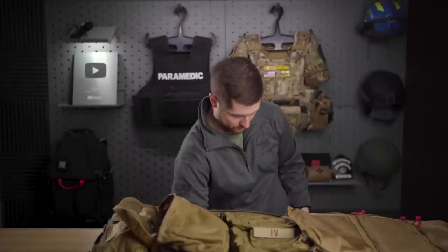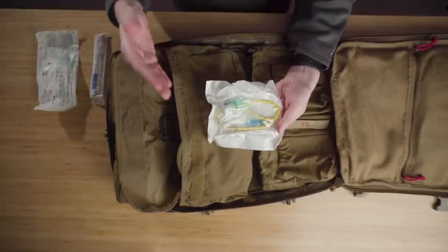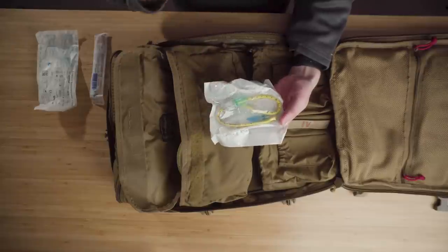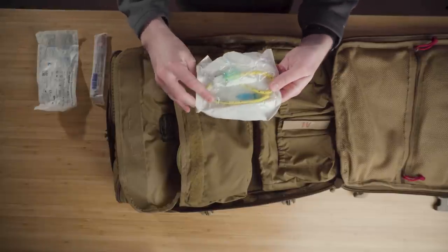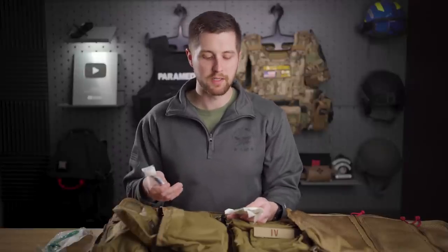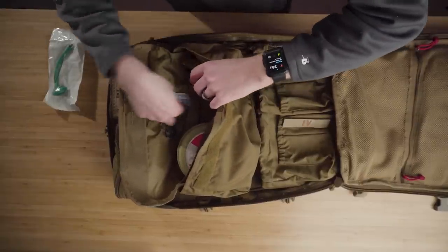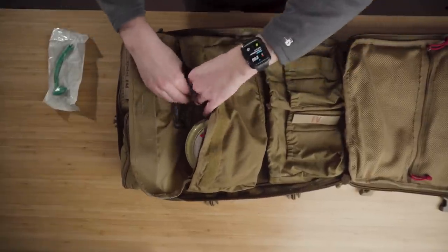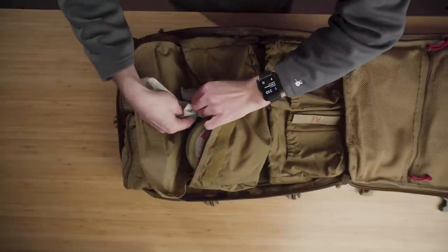Next, I have a NAR tracheostomy kit — the cric kit with a bougie introducer. It's a short tube for a cricothyroidotomy and a shortened bougie to help introduce it; pretty much everything you need to initiate that procedure. Next to that, a scalpel to make the incision. This is an airway we will use in the tactical environment once we get a patient to a secure area. And I have an NPA — a basic airway adjunct — with lubrication taped to the back of it.